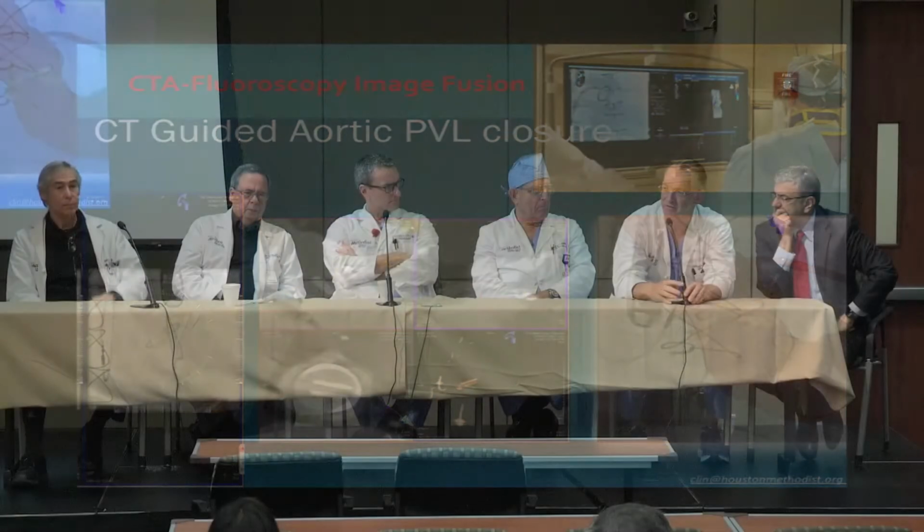Just not having necessarily skin in the imaging game, you really want both. I see them as complementary. You need the echo to quantify things and somewhat localize things, and you need the CT to define the anatomy and where the lesion is. Let me give you my recommendation.